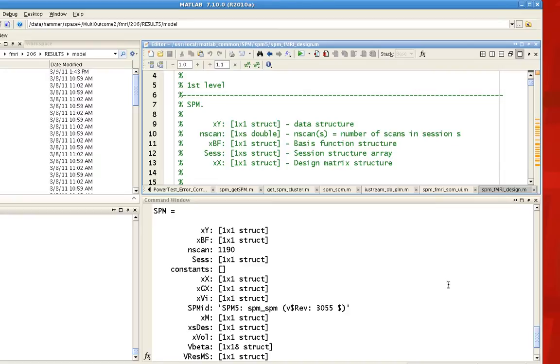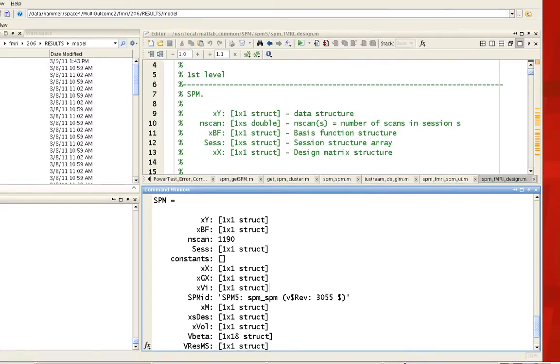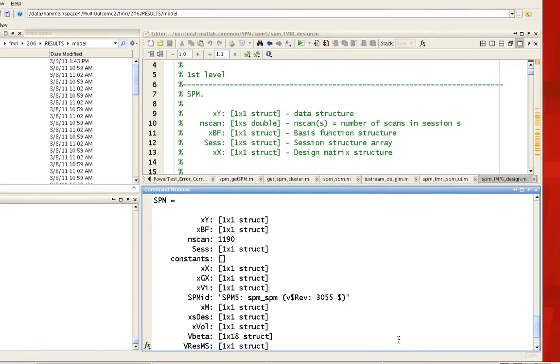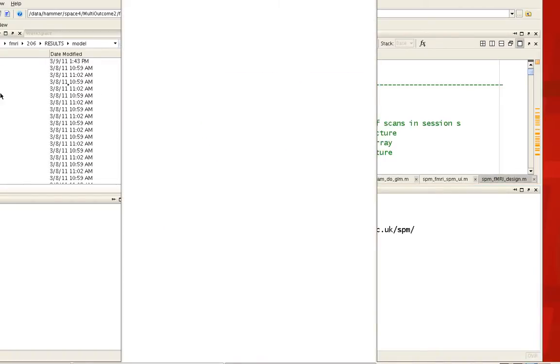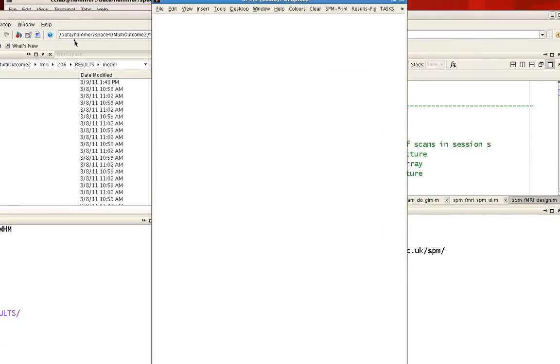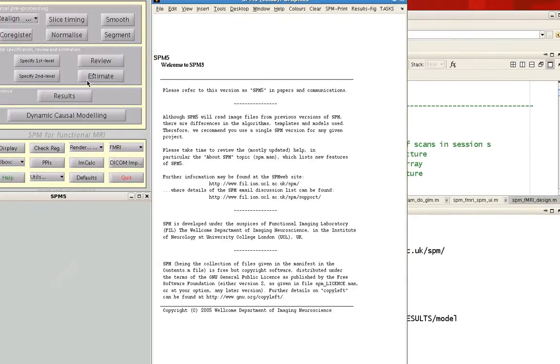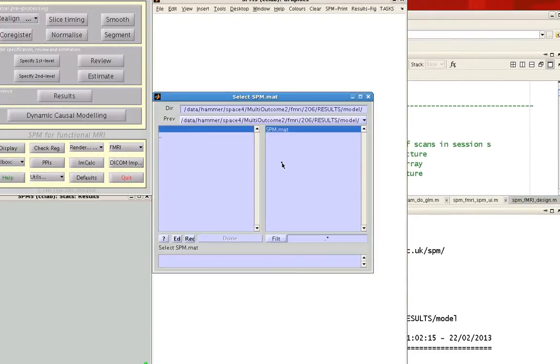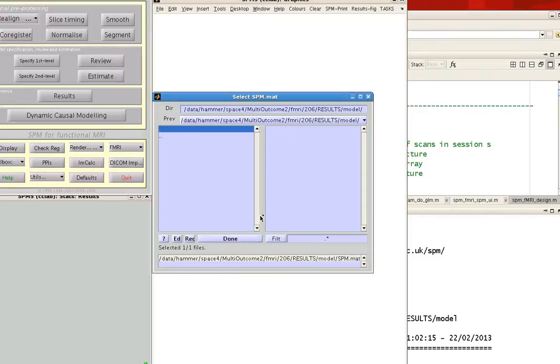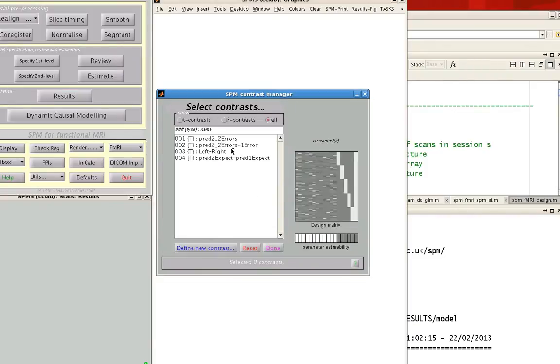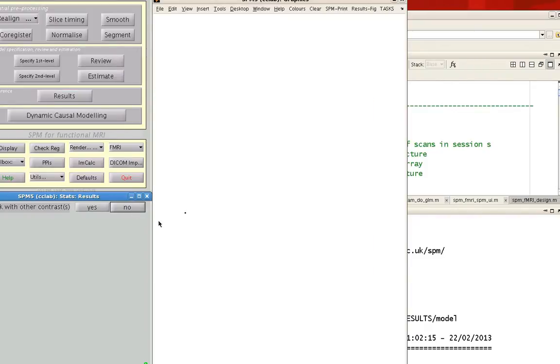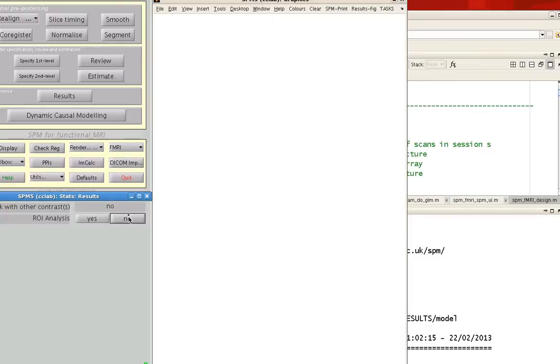Lastly, when you actually load up an SPM.mat file and you run things like a contrast on it, I'm going to go ahead and do that. Look at the results, load the SPM.mat file, and then let's say I'm interested in a particular contrast.